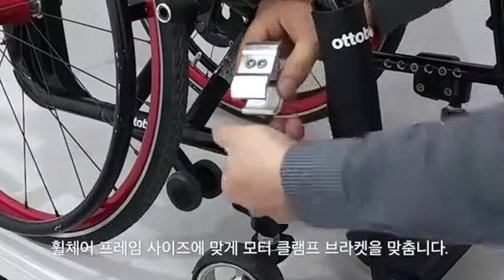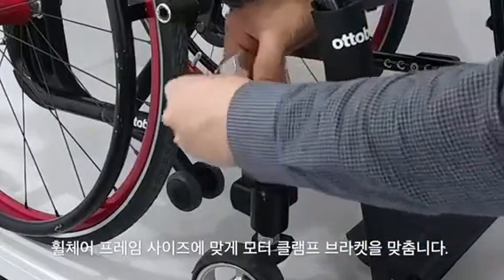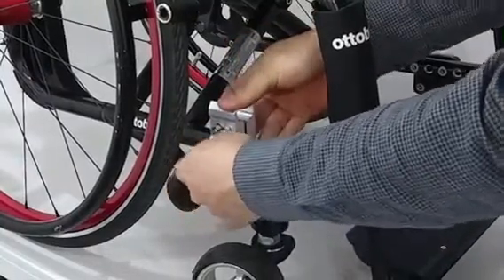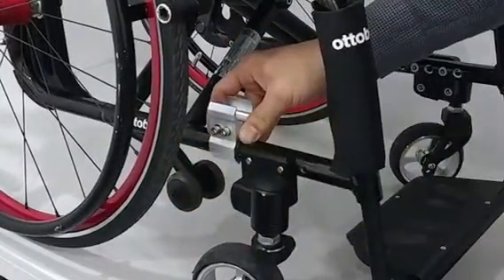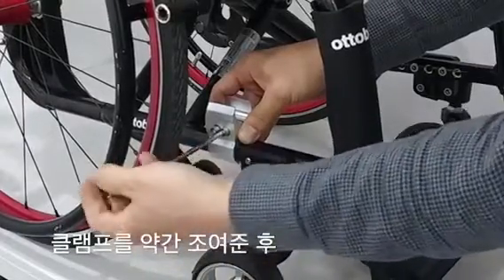Fit the clamp's bracket on the proper side of the wheelchair's frame. Then tighten the clamp slightly.